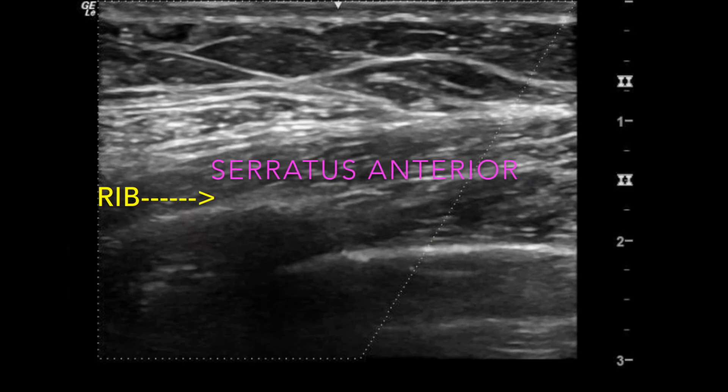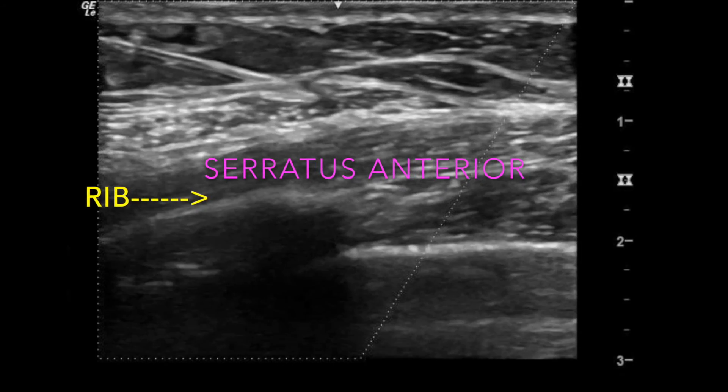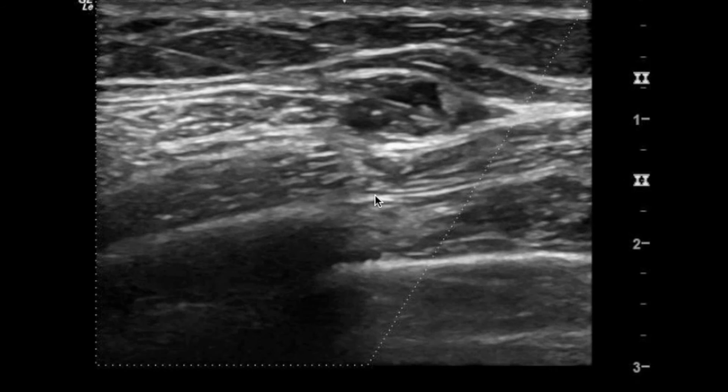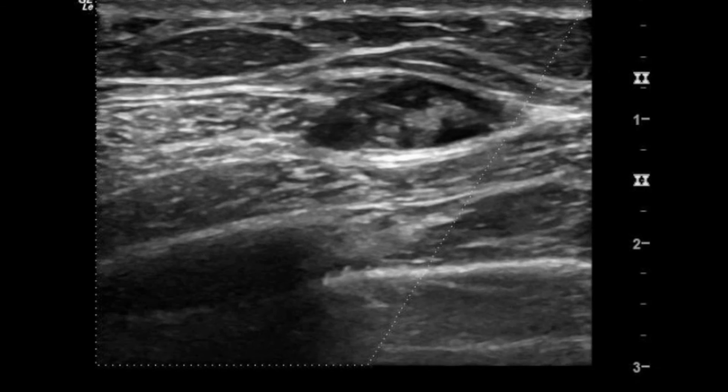This ultrasound clip shows the needle approaching the serratus anterior muscle overlying the bright white rib below. You'll feel a small pop through the fascia. After a small test push of anesthetic to confirm placement, inject the anesthetic, watching the serratus separate from the latissimus dorsi.